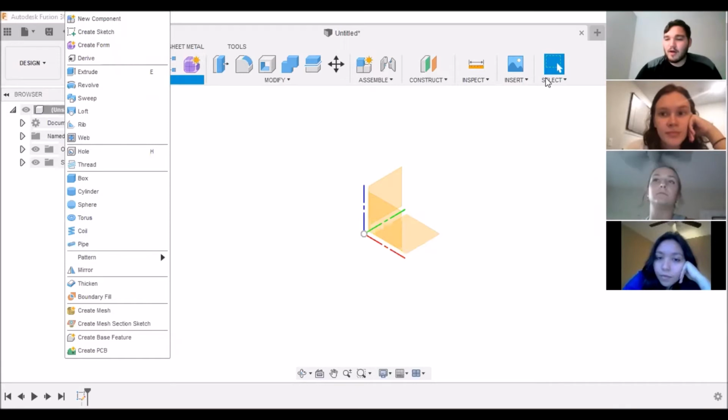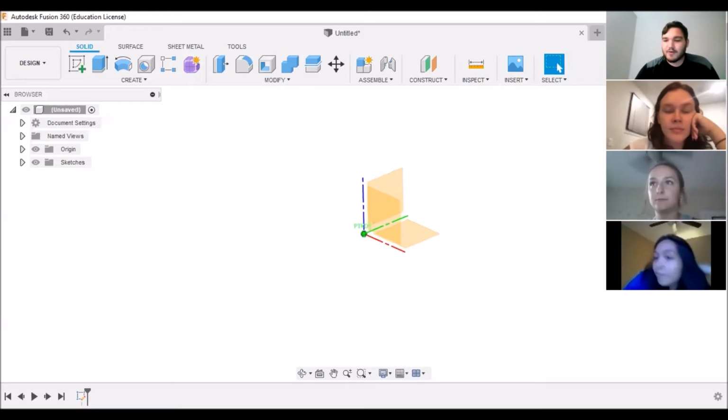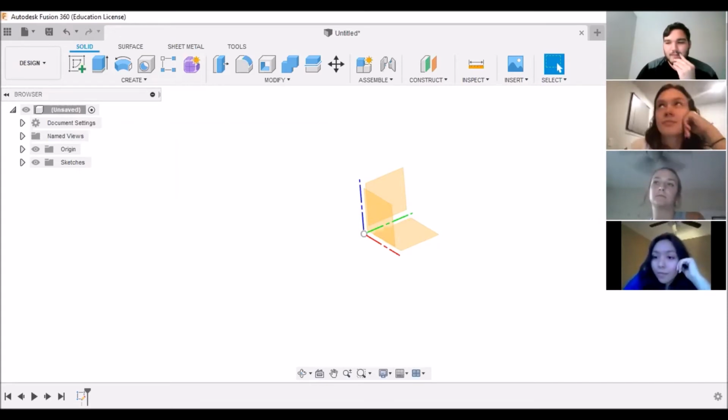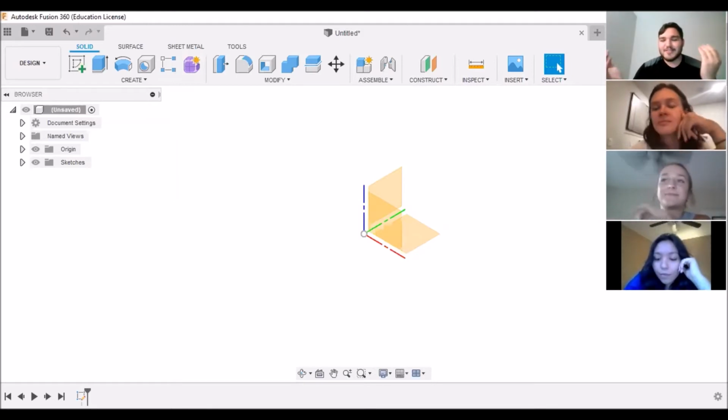So with e-NABLE, my favorite thing to teach is always let's just design a finger, right? Super easy, super simple, and it's got some pretty decent geometries. So what does a finger basically look like if you were to break it up into just purely shapes? Probably just a cylinder and then maybe a half a sphere on the end. Yeah, perfect. And so let's try to make that.